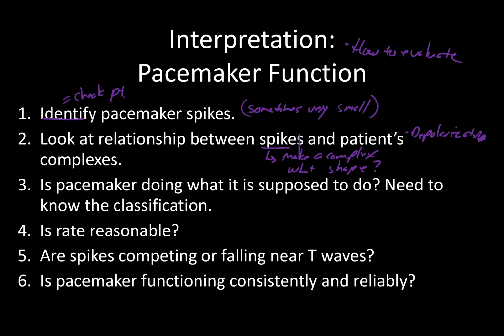Next thing is, is the pacemaker doing what it's supposed to do? You need to know what the classification is if you're going to dig into that. Often I strongly recommend checking the EMR, or the patient's supposed to have a card that states what brand their pacemaker is and things of that nature to try and learn what's going on. Contacting the pacemaker rep is a great place to start too, because if you know what brand it is, then you can call them and they can look up that stuff on their records. That's a few extra steps.